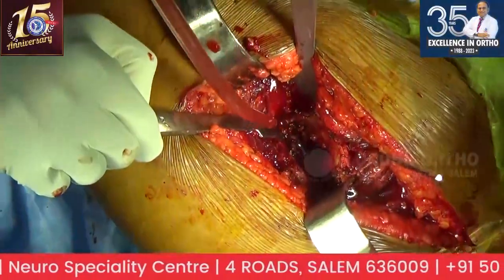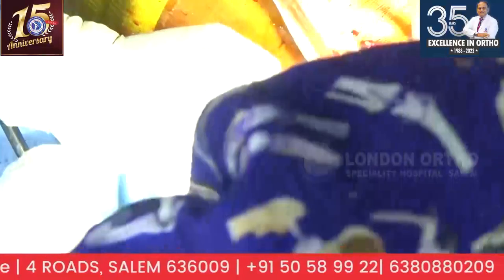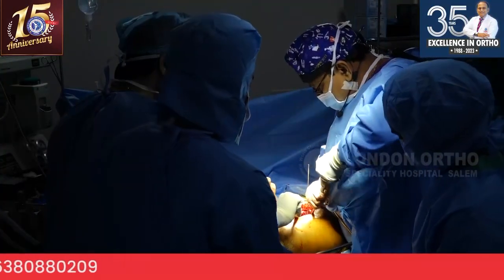So I take a long Chandli curette, remove all the soft tissues. Medial wall is very weak.